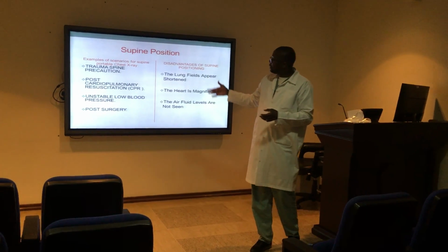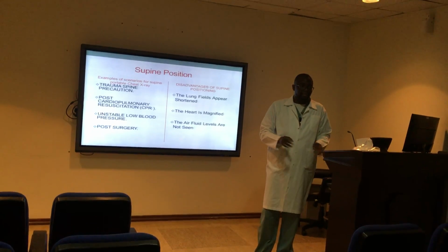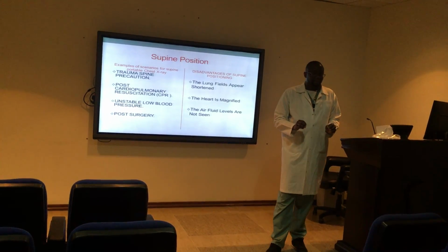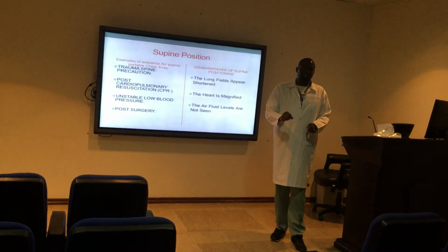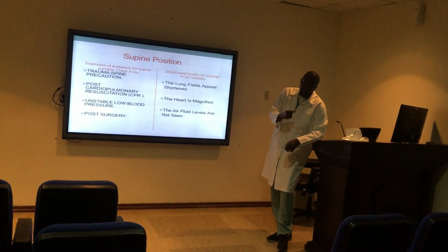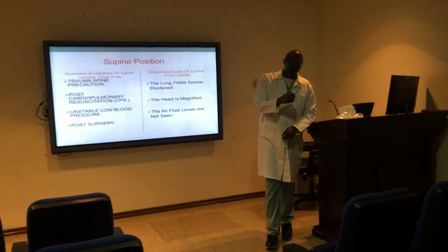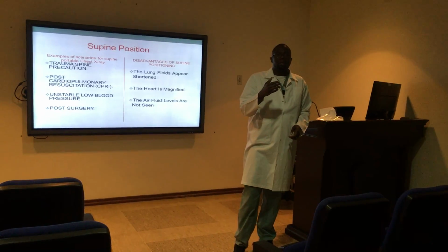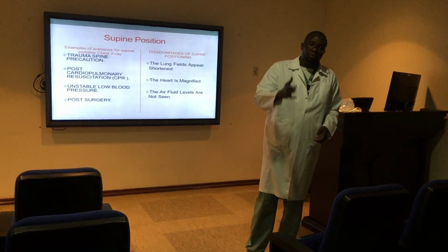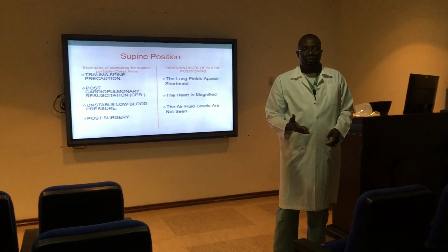These are some of the major scenarios whereby supine is okay. We don't force anything here. Patient care, their safety is more paramount than any other thing. We should be patient advocates. Now I will show you the reason why, whenever it's possible, and most of the time it will be possible, to avoid doing the X-ray in a supine position.